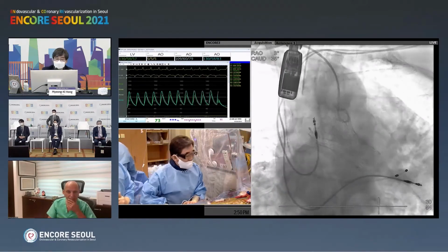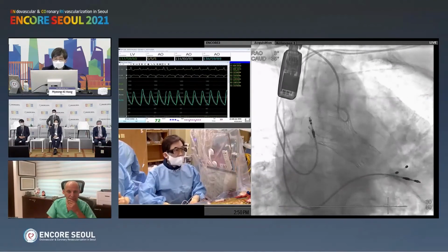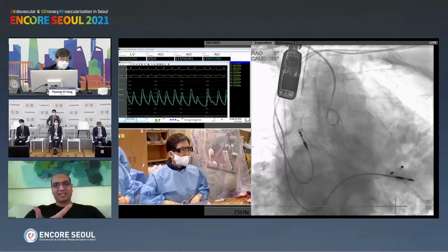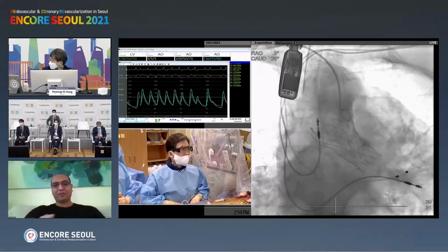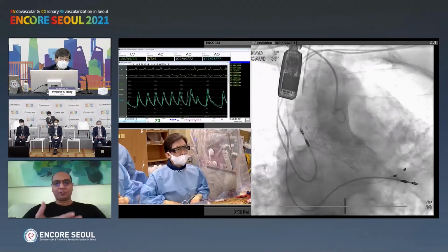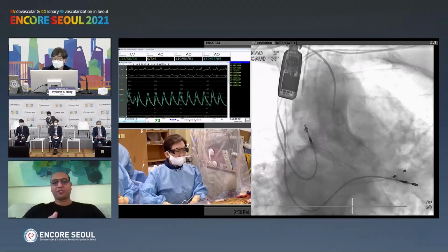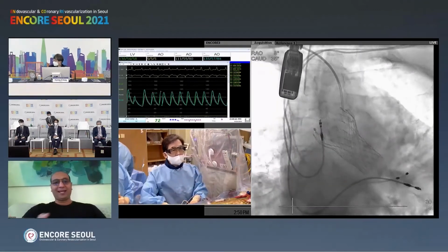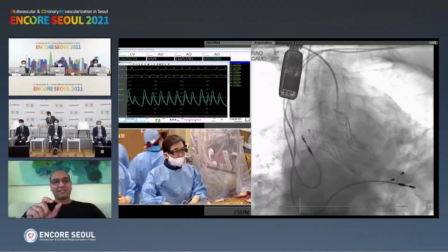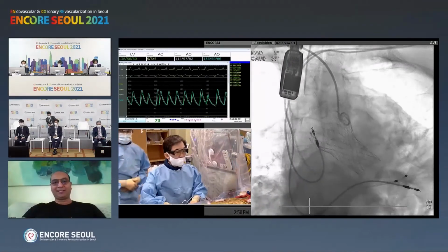How about the opinion, Sate? As usual, Professor Kim, picture perfect implant. I think this is a frail lady. She's sick. She's got some renal dysfunction. You have a great AI index. The jet could look exaggerated in the echo because of some anemia, hyperdynamic circulation. I wouldn't be too obsessed about it. Diastolic pressure is good. Fluoro looks good. AI index looks good. I think it's a great case. I love the way the valve tilted a little more to the left than to the right, but it's a beautiful implant and a great result.